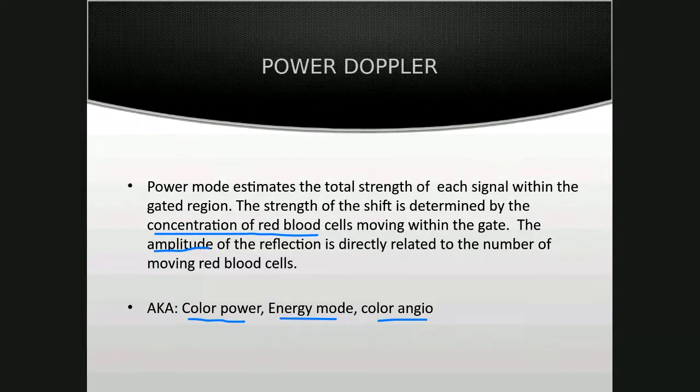In fact, power Doppler is very limited. The only thing we can tell with power Doppler is, is there flow? And it's very sensitive to super slow flow. And is there a lot of flow there? And let me show you the picture.